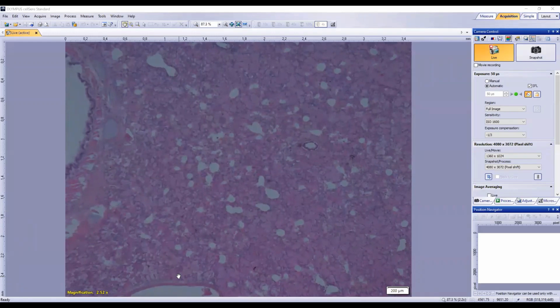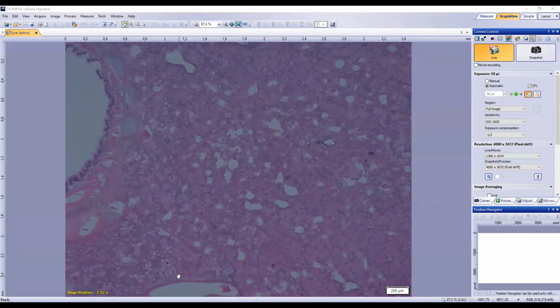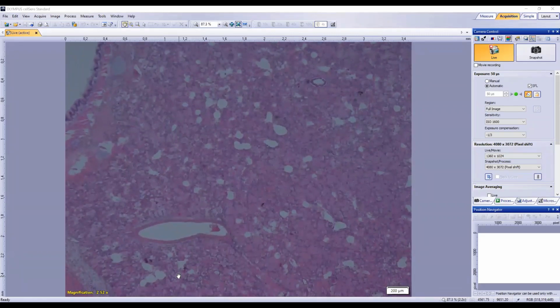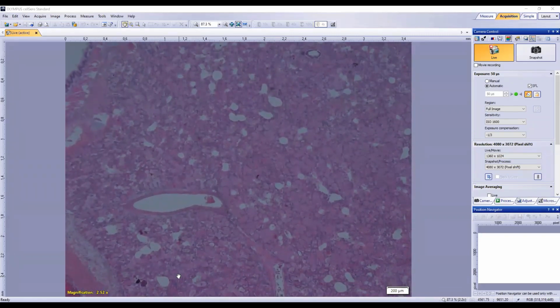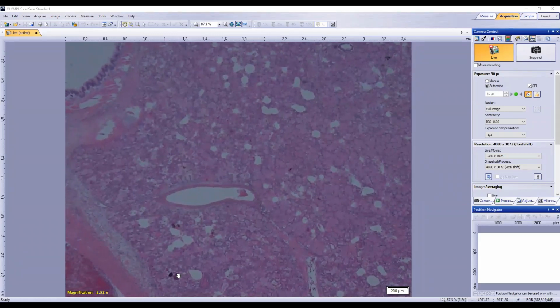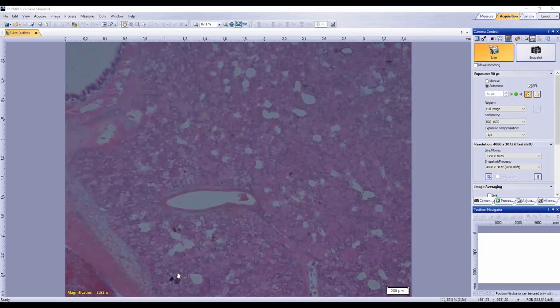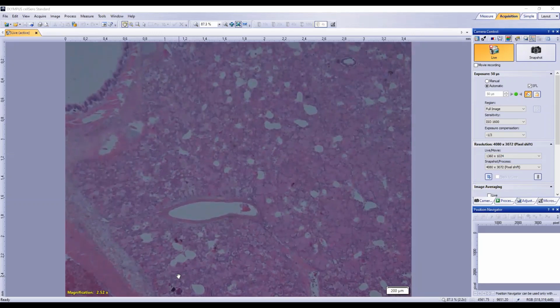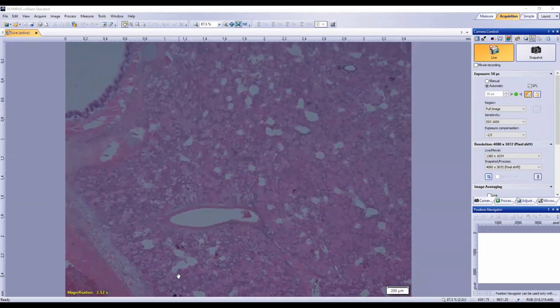But what we'll end up doing over these sessions is coming at the same organ in a bunch of different ways depending on what the process is. So things like lungs and kidneys we'll do in multiple different ways because there's so many compartments to describe. They're great descriptive slides. So there'll be certain things that we'll skip over in some, but we'll cover in others.